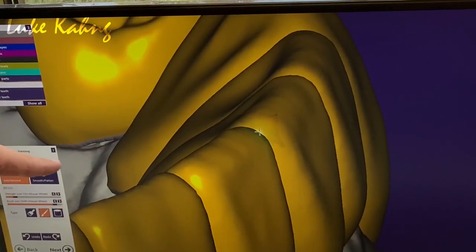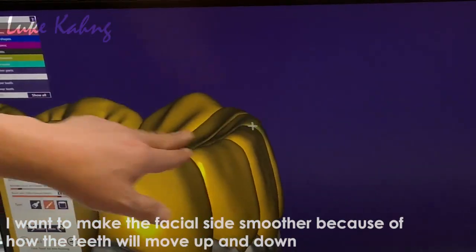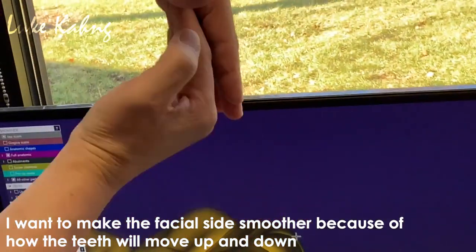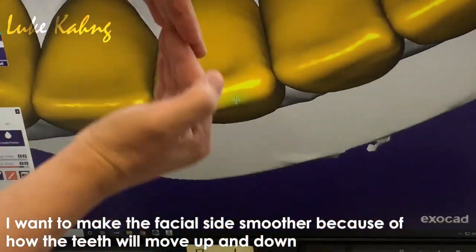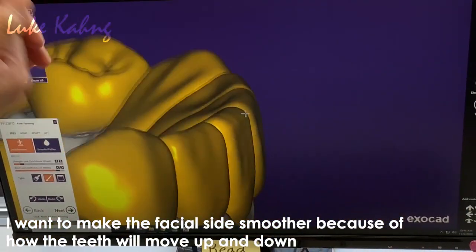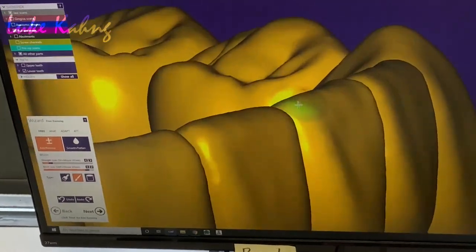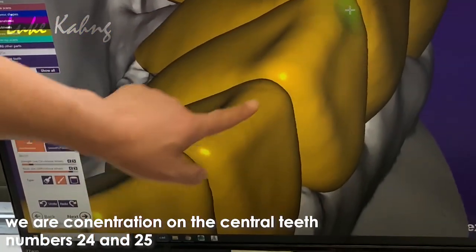Yeah, just like that. So, make it smooth, put the slide in. Move the lower, upper, from here and below. Concentrate on the central only, 24, 25. Just like that, then the other side.